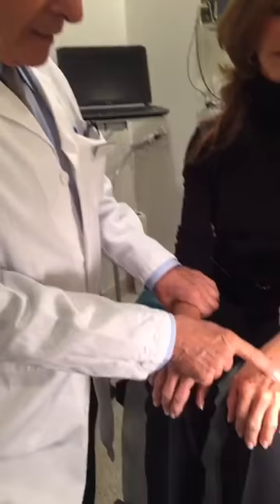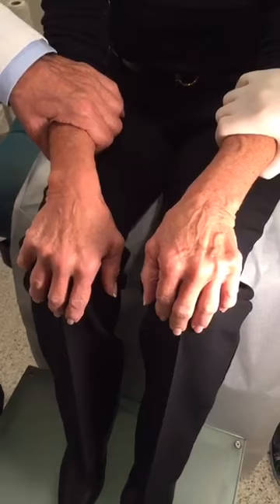I am Dr. Navarro, director and founder of the Vein Treatment Center in Manhattan, and today we are going to inject and remove the veins in the dorsum of the hand on Camille.